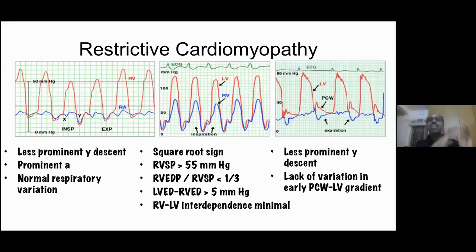So the pulmonary venous return in inspiration is low in all normal people. This results in a reduction in mitral filling and aortic filling in inspiration, to a minor degree.